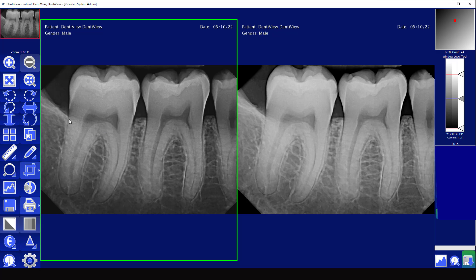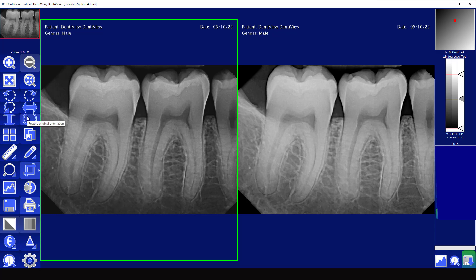The next buttons in the tools are your basic flips and rotates, which allow you to orientate the image correctly. Normally you won't have to use these if you chose the correct tooth association when capturing into the software, but they are there if you need them. The next set of buttons are the manually arranged images and automatically arranged images.